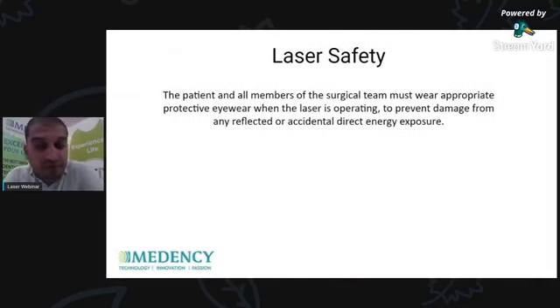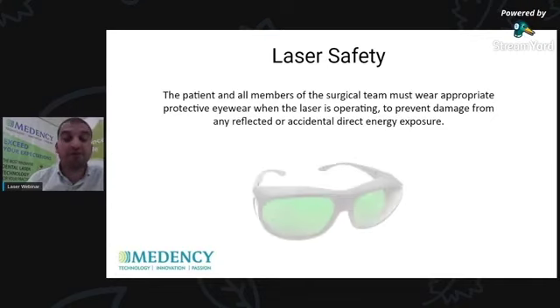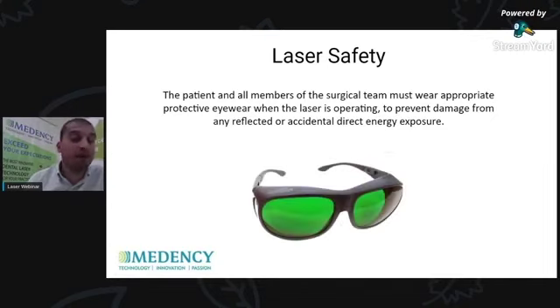One of the most important things we have to know and understand when we use laser is that we have to be safe. Our patients and our assistants and the doctors must be safe from laser. Is laser safe? We can say it's safe unless you don't use the given precautions. The first thing, we have to protect our eyes. For a simple equation, we can say laser likes to bind with melanin. Eyes contain melanin, and this we have to protect.